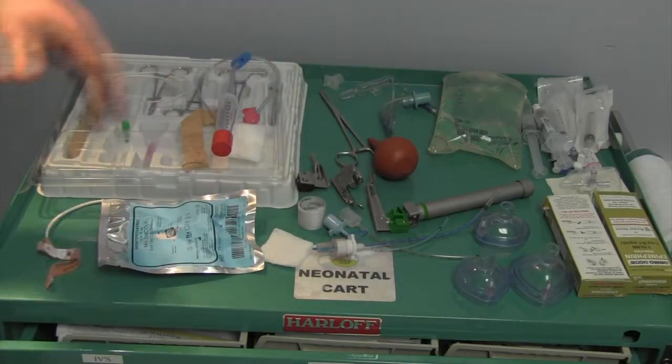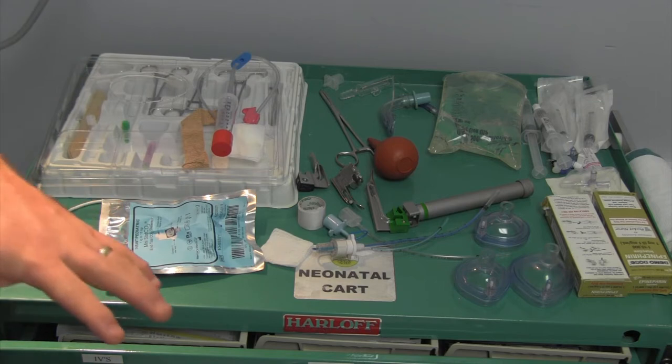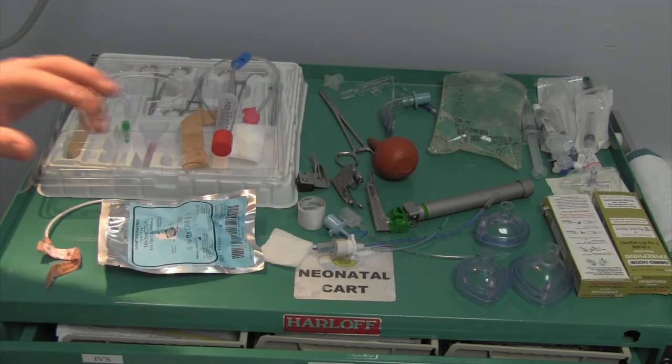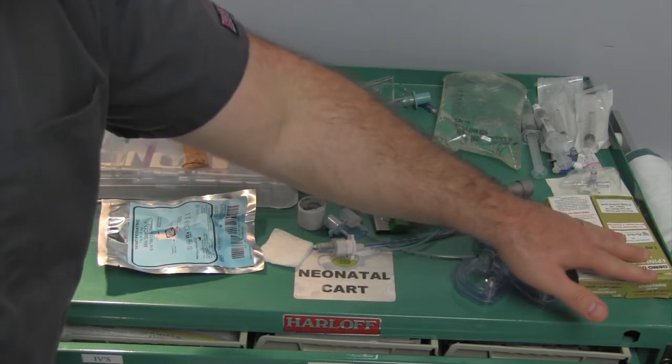I'm back here in the neonatal resuscitation room and I want to give you a quick rundown of what the table looks like - the equipment we have available for an at-risk delivery. So let's get over there and take a look. This is the table we set up for our neonatal resuscitative simulation. I'll go quickly over this and then talk specifically more about some of the respiratory items. So epinephrine over here, one of 10,000 solution.